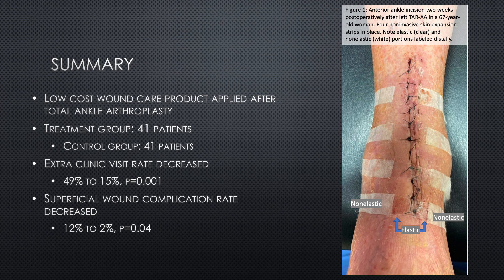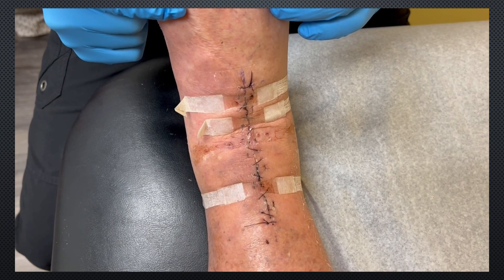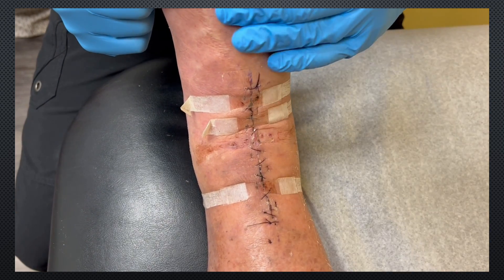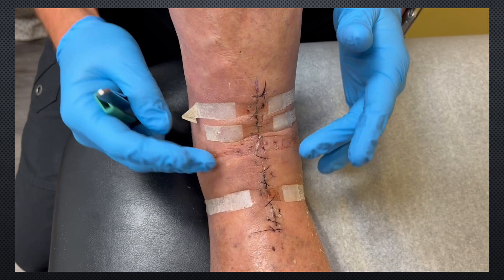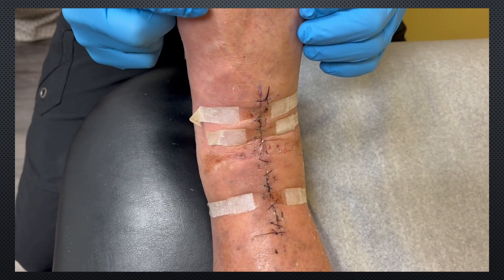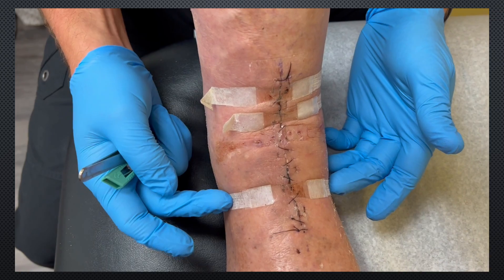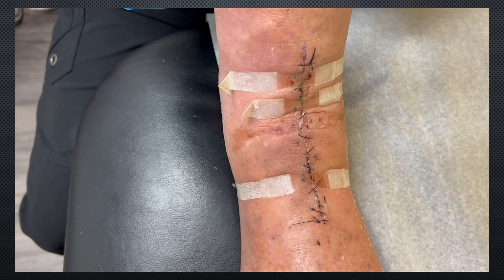The following videos demonstrate application at the post-operative visit. We're at a post-op visit for a total ankle replacement. This is proximal up here and distal down here. We put these Dynaclose strips on. You can see one of them fell off already, but here's what they look like. It's sterile strips on both sides, and then it has this elastic in the middle that's helping pull that incision together.